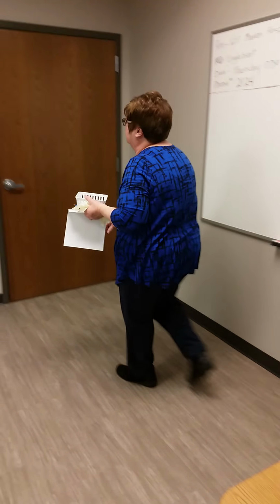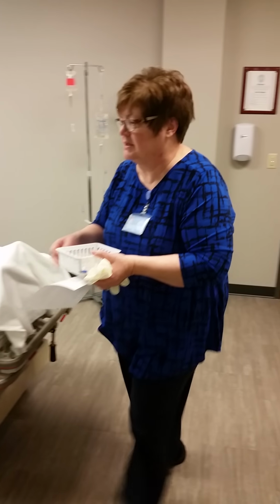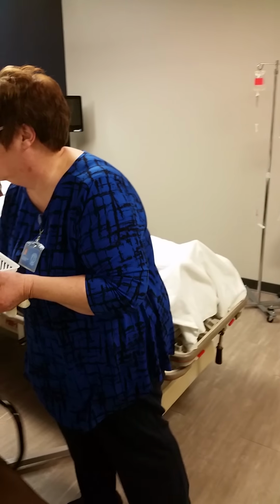So, I go over to the door, I knock. Hi, Casey. I'm going to set my supplies on the bed. The table is clean. My name is Linda. I'm a Marian University student nurse. Hand hygiene before I touch my patient.